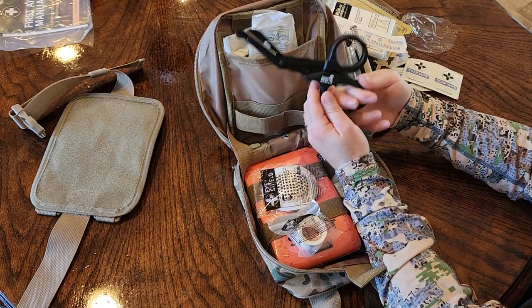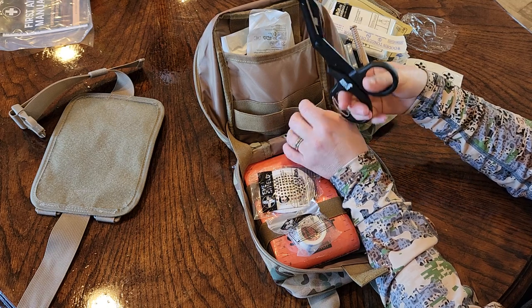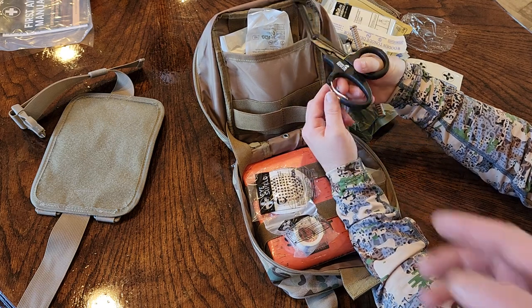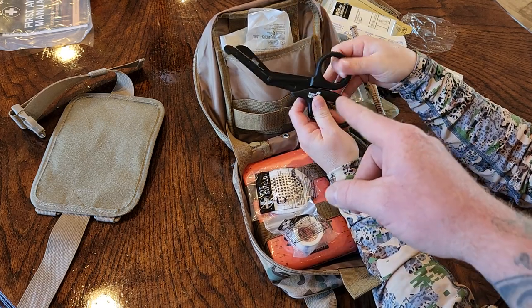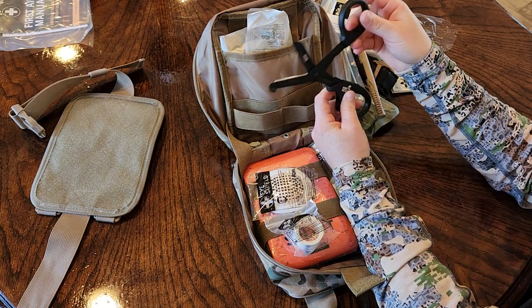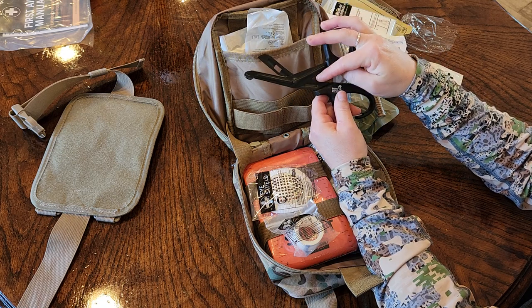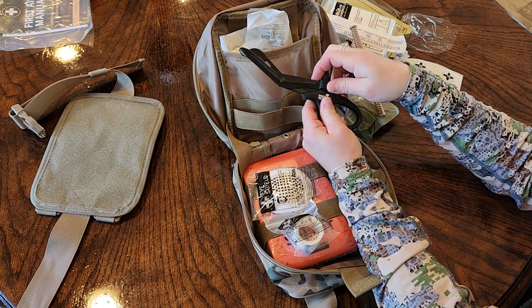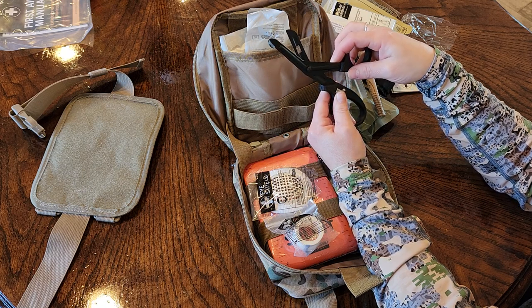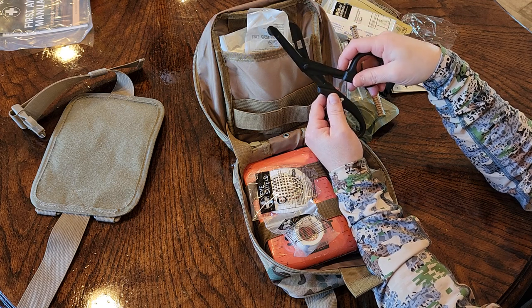And these are nice. Only on drunk patients, probably. Now the whiny ones. The whiny babies. All right, so these are pretty nice. Is that a valve for an oxygen tank or something? Yeah, you can do a small oxygen tank with that one if you need to. And these, the little grips in there, that's cool. Never seen the grips on there before. You just tell somebody to stick their finger in there and just clamp it off. I'm just kidding.